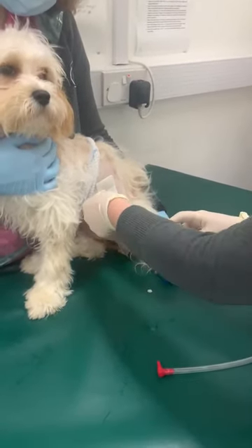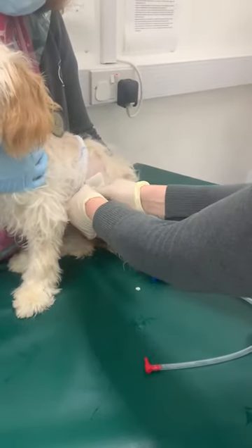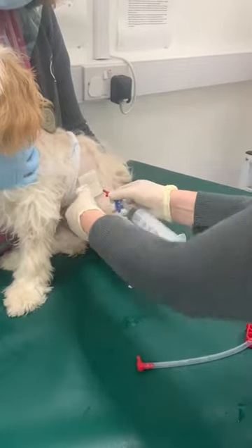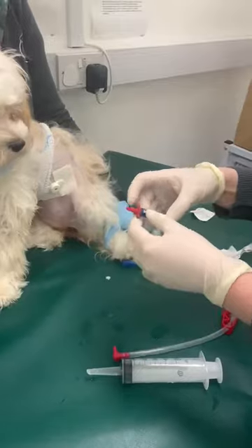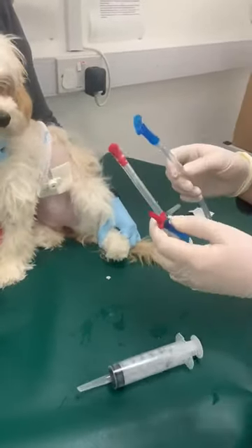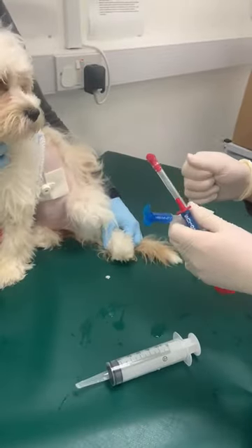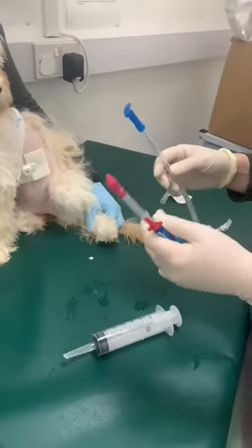Once you're finished, sometimes you get a little bit of leakage. If you just pull the whole thing out, that's the best way — if you only pull the syringe out you'll get leakage. These little attachments need to be stored in sterilisation. We use the Milton sterilisation formula because it's really gentle and easily accessible.